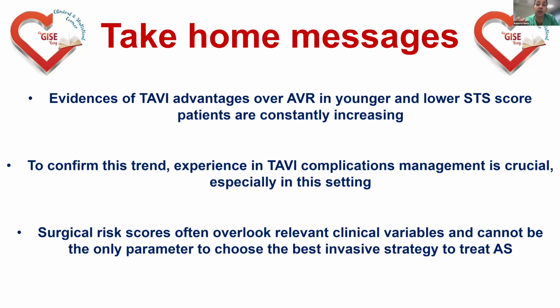No, we use it in every patient, because it's something that takes you 2 minutes. And also when you don't need it, you facilitate your hemostasis, because you use, for example, a balloon, and then you can use your proglide. We use a sequential technique to be sure that we need a second device.